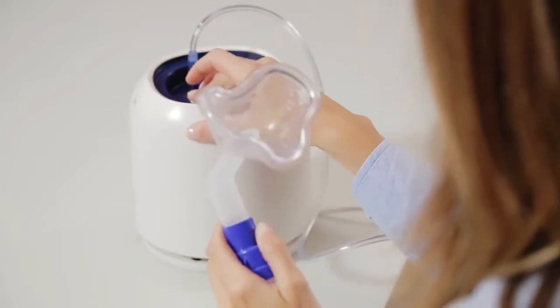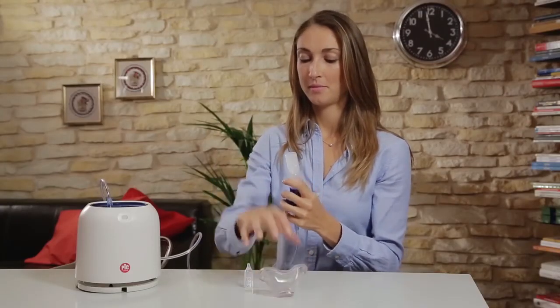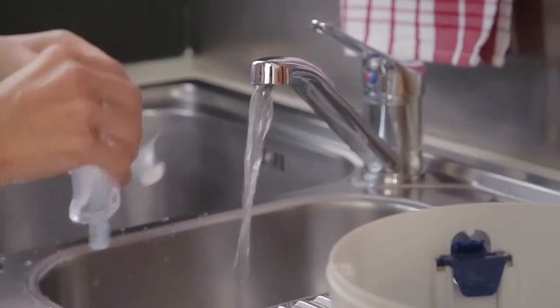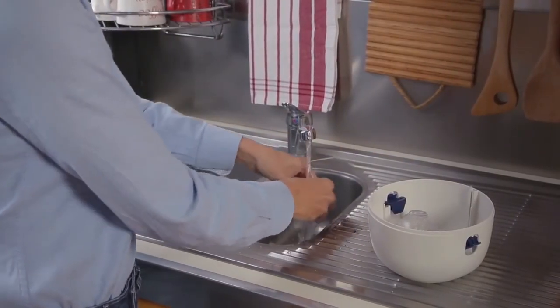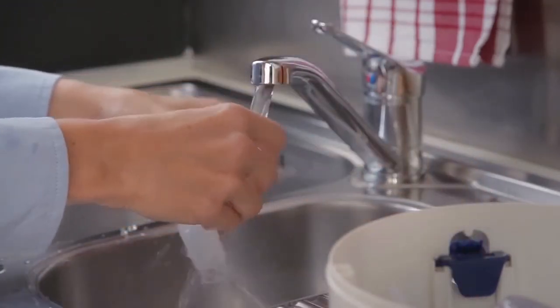Turn off the device, unplug the power cord, remove the accessories you used and wash them under running water. Do not wash the tubing. If you want to clean the accessories more accurately, you can sanitise them either with baking soda or a food disinfectant.